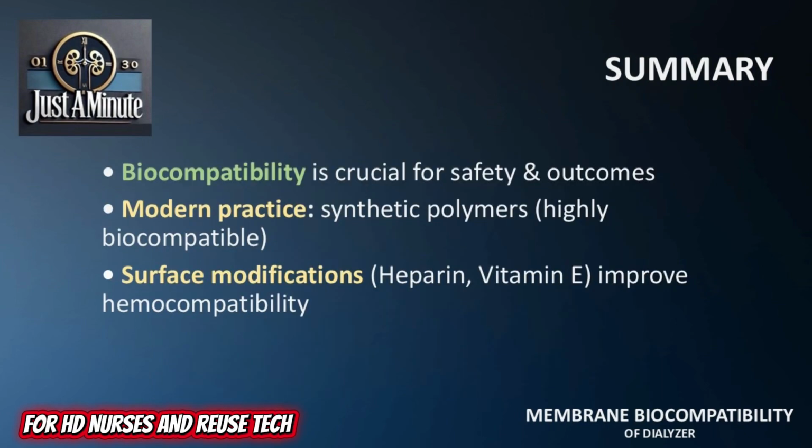In summary, membrane biocompatibility is central to safe and effective dialysis. Advances in membrane design, from cellulose to synthetic polymers, have significantly improved patient outcomes. Surface modifications such as heparin or vitamin E coatings represent further improvements in hemocompatibility, reducing both acute and chronic complications.